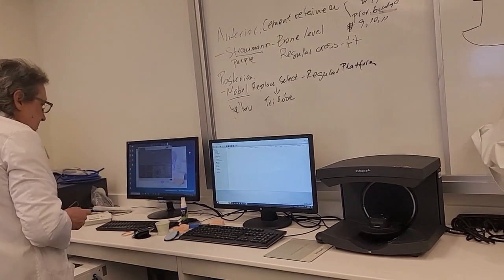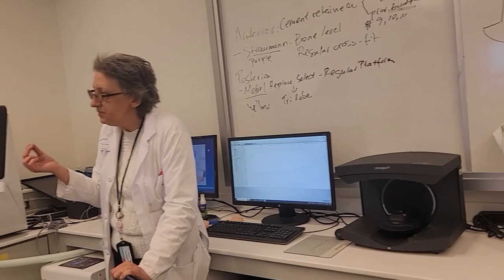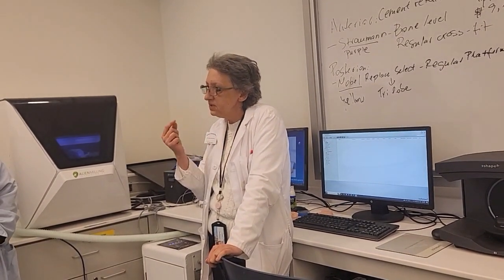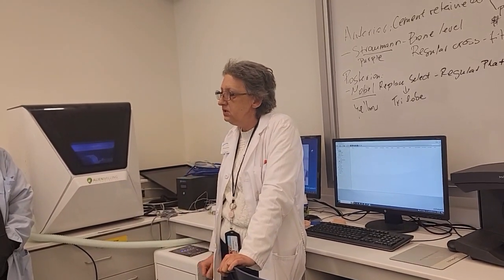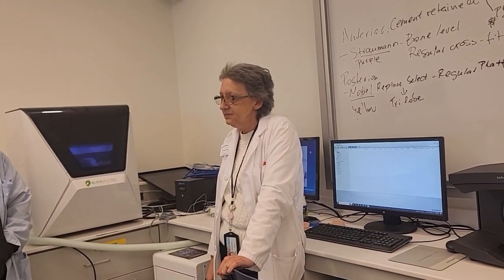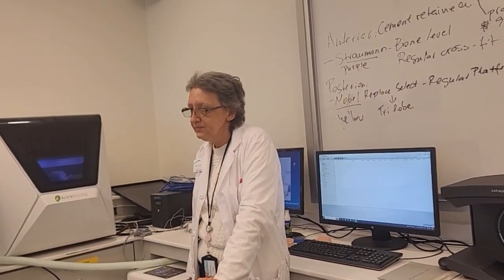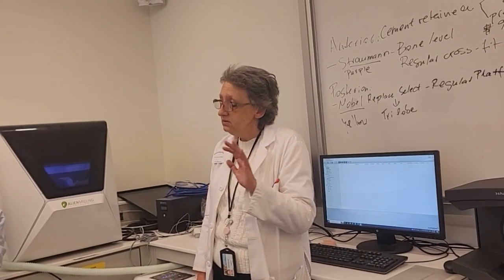So I'm asking you these questions to make a correlation to how your custom abutments should look. So when we design the custom abutment for the anteriors, the ones that you're going to do, it's an anterior custom abutment, so how should it look? It should look long and narrow. Long and narrow, perfect.